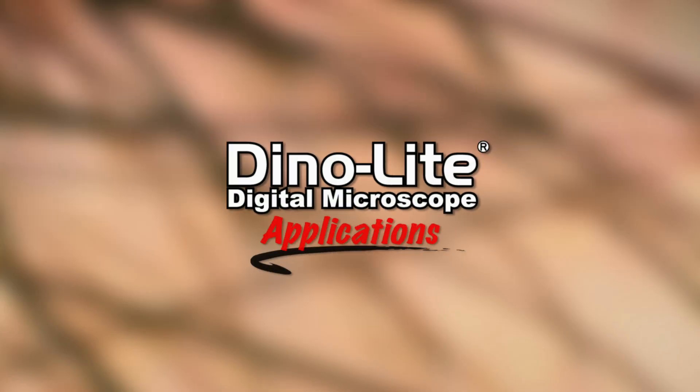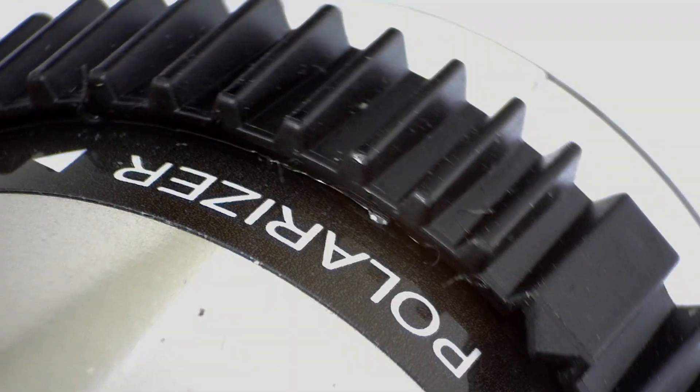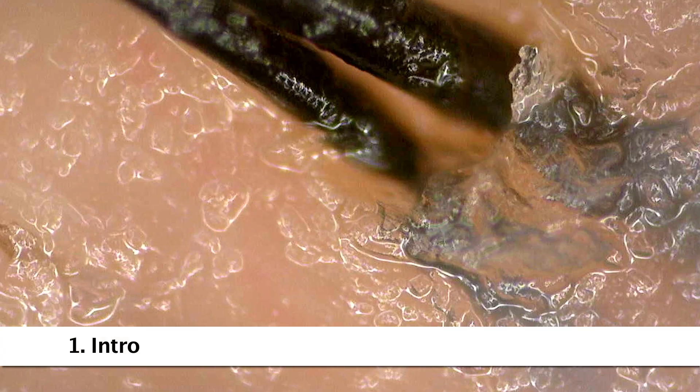This is a Dynolite digital microscope video focusing on hair and scalp applications. The Dynolite is a handheld microscope camera that connects to a computer via USB.